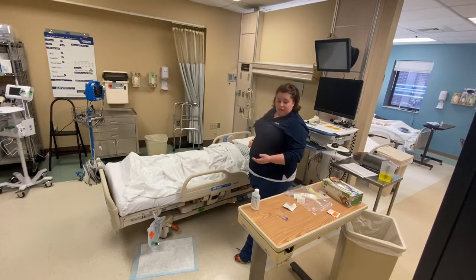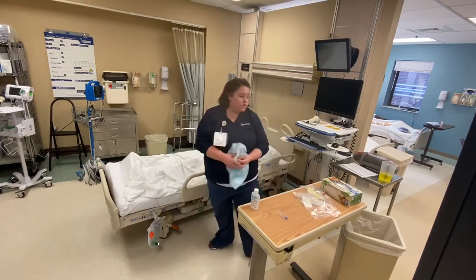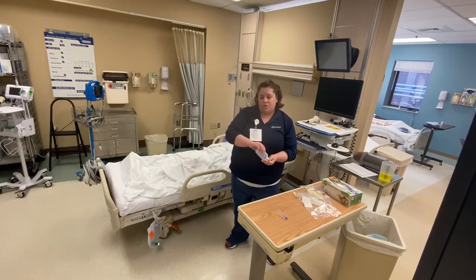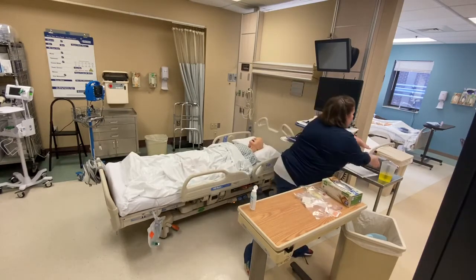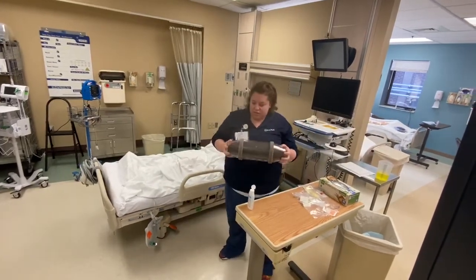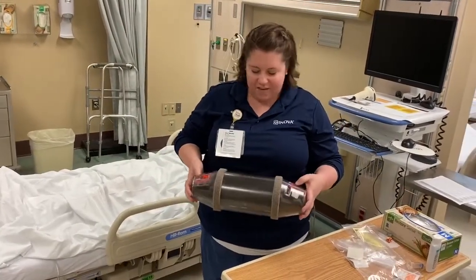Once I finish all of that, I will take my specimen that I collected. I'm going to go to the tube station and I'm going to send it. So I want to show you guys real quick what the tube canister looks like, because I know some of you may not have seen that before. So when I go to the tube station, this is what I'm going to find. So if you've used the bank, you may have seen this.